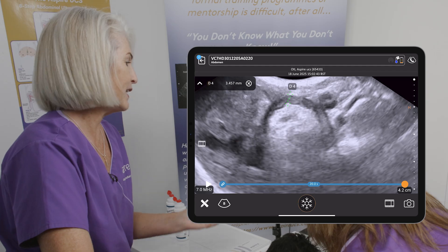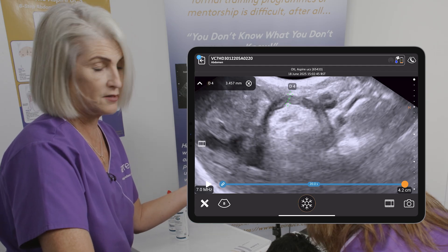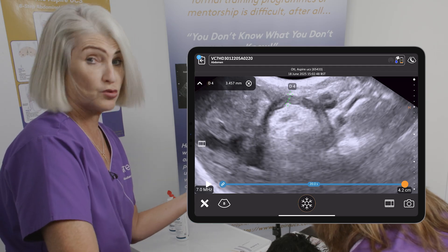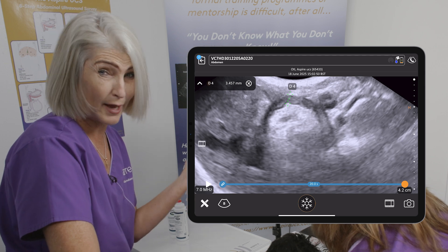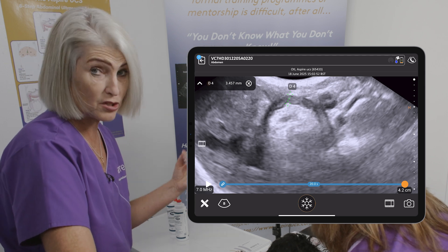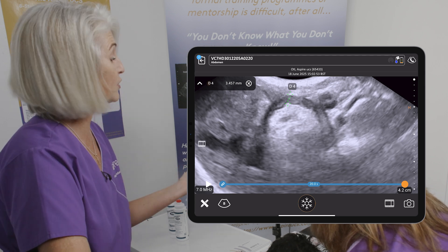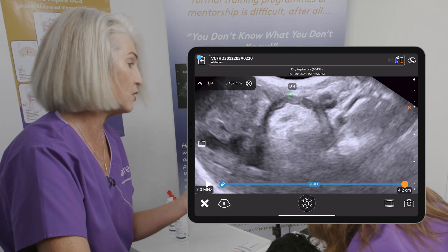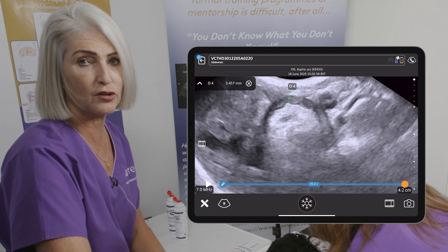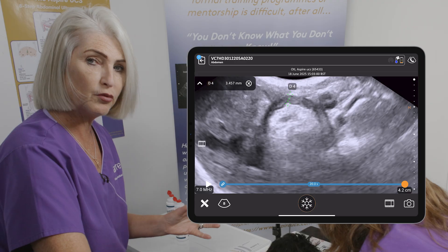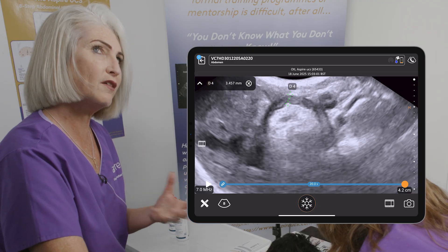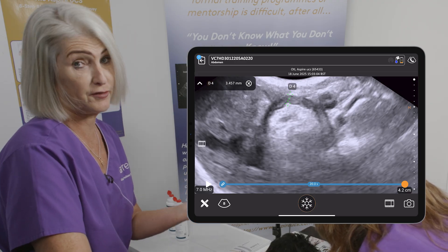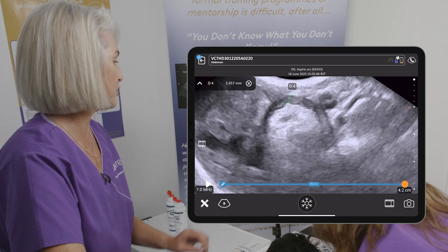It makes sense that if you have a lot of gas in the stomach you're not going to see the dorsal wall, because gas is our enemy — the sound can't pass through it. So unless we turn the patient over and look from the other side, or come underneath the dog, we're going to struggle to see that dorsal wall. It's really important to think of it as a hollow structure and try to assess as much of it as possible.